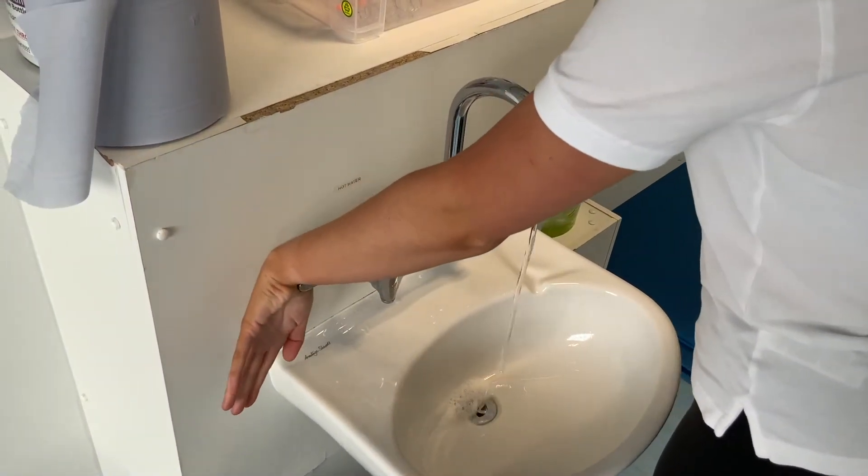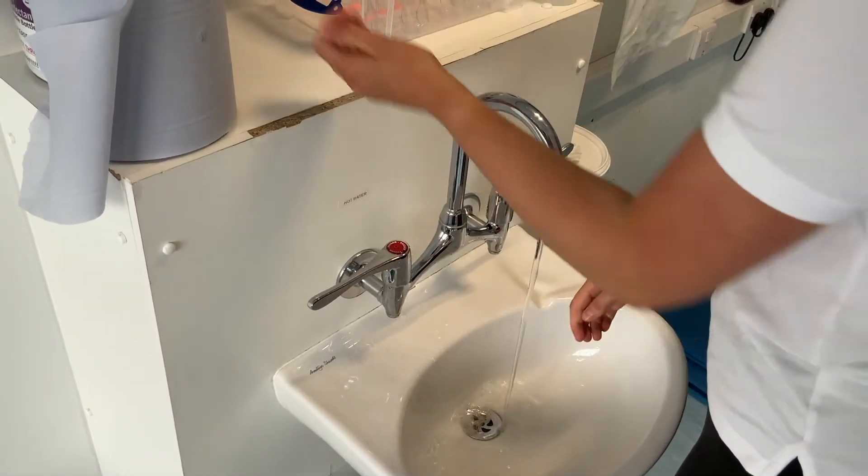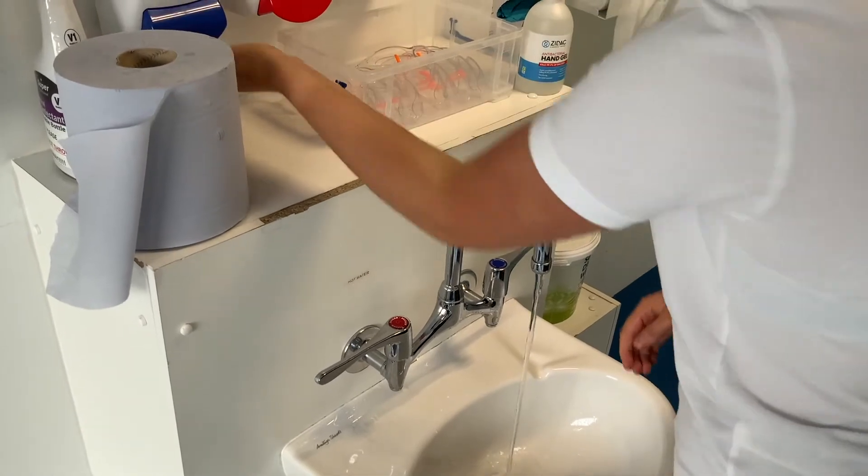In this video I'm going to be demonstrating transferring a patient from the bed to a chair using a rotary turner.